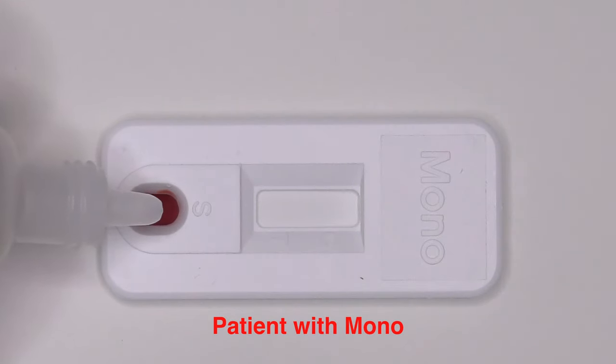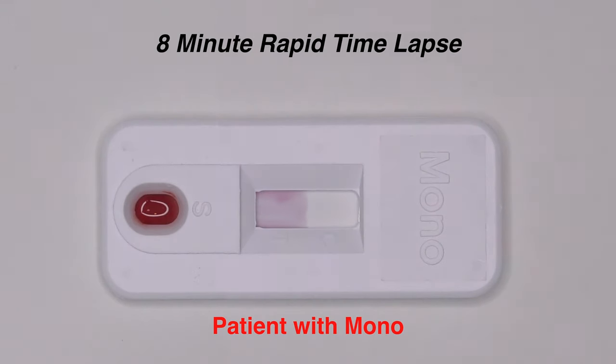Here is an 8-minute rapid time lapse showing a positive mono-spot result. The red arrow points to the control band to ensure the test is valid. If this red band is absent, any test results, whether negative or positive, would be considered erroneous and needs to be repeated. The blue arrow points to a second band that should appear if mono is present, indicating a positive mono-spot test. As such, if two bands are present, the patient has mono and should be treated accordingly.